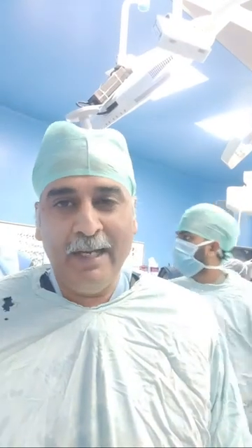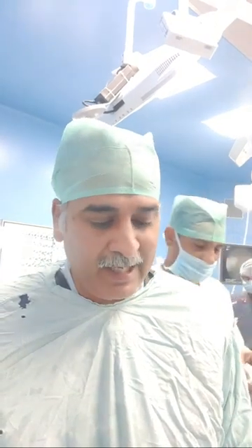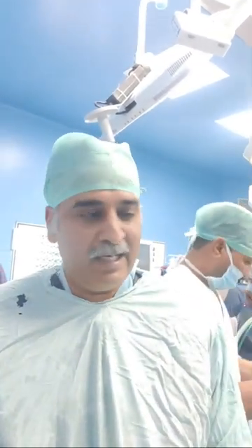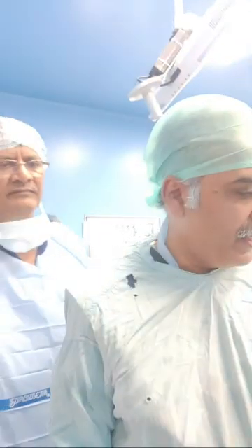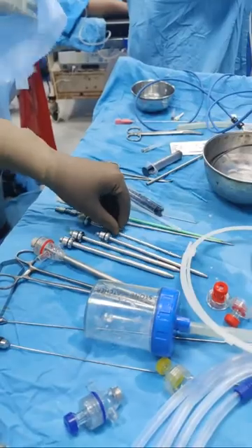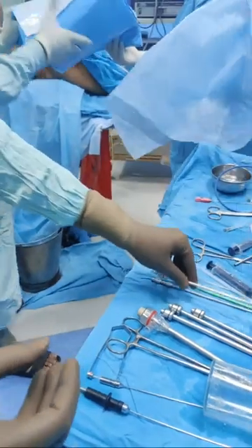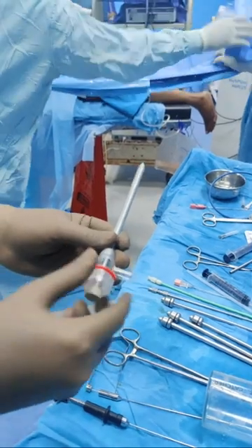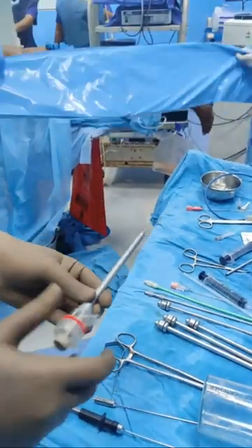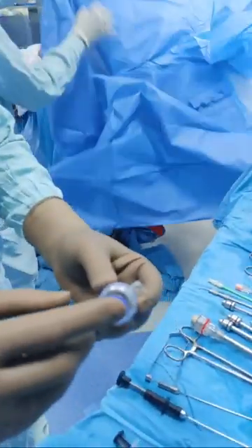of PCNL. So we would be starting with a case which has a large stone. It's almost a staghorn stone. I will show you the x-ray in a minute. And in the meantime, I can just show you the instruments here. We have these sheaths with dilators, which range from 12 to 24. And this is along with the sheath. And then the other part is what would be called the suction master.